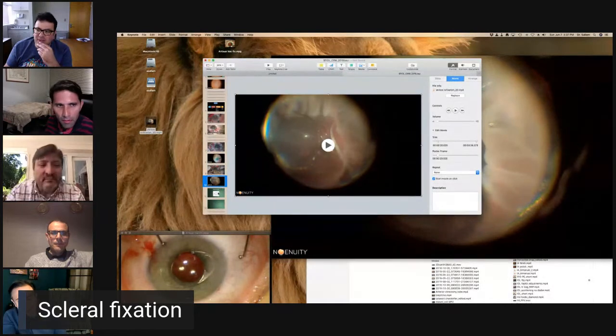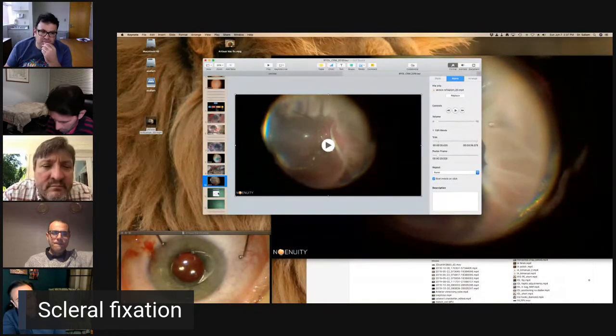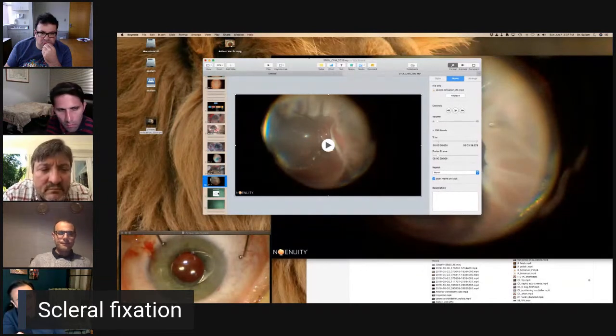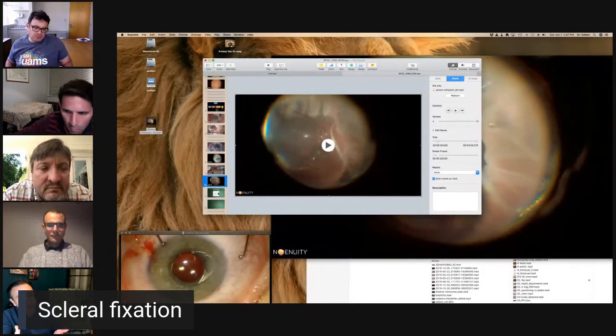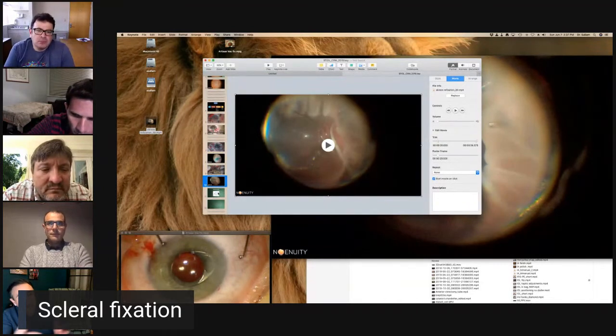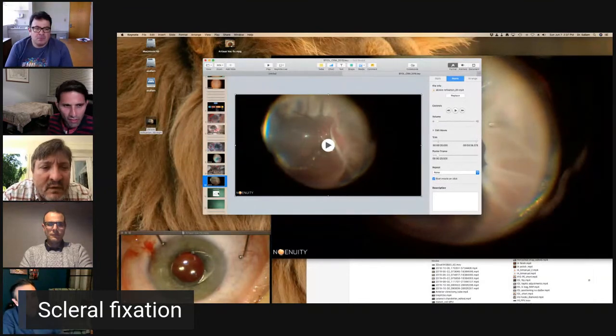But one of the things I found with Gore-Tex is that to start with, it might look very flimsy, very thin, but a few minutes later, it expands again and fills up those sclerotomies. Again, I use 27 gauge. That's my experience with 27 gauge sclerotomies. I've never stitched any Gore-Tex sclerotomies. I think 27 gauge particularly would be better positioned. It's slightly difficult with dunking. That's my experience. Yes, that's true.